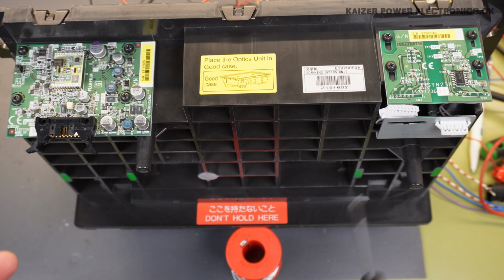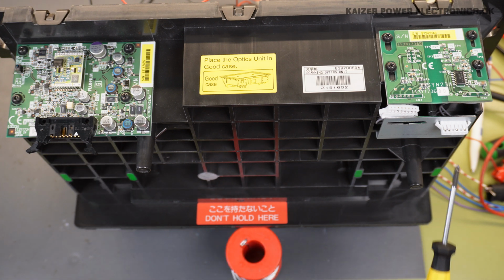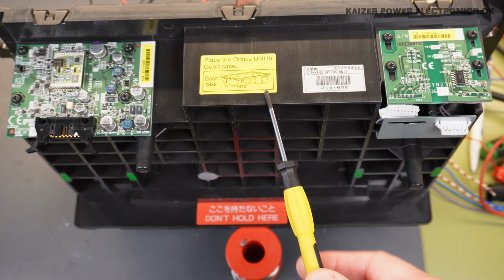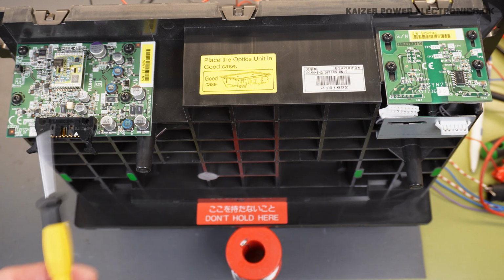The case only has two connections. We have one for the laser module, the LDD23A, and we have the scanner motor module, which is called SYN23A. Place the optics unit in good case. This is the good case. Luckily, we have the good case. Do not hold here, so let's not do that once again. Let's take a closer look at each of the PCBs.